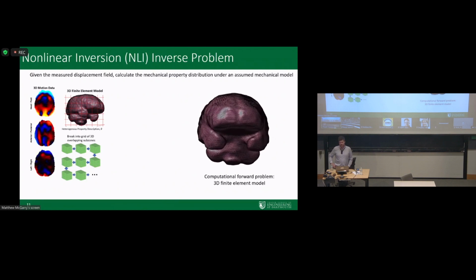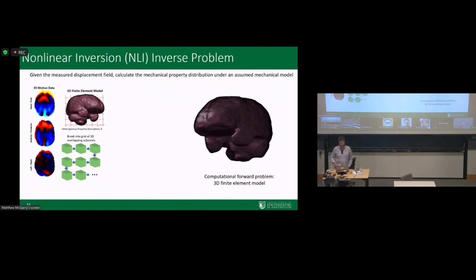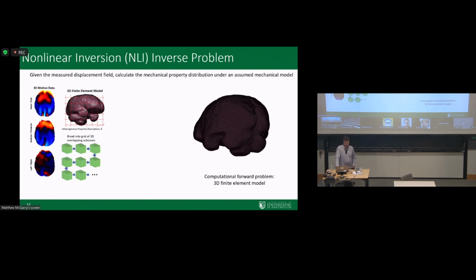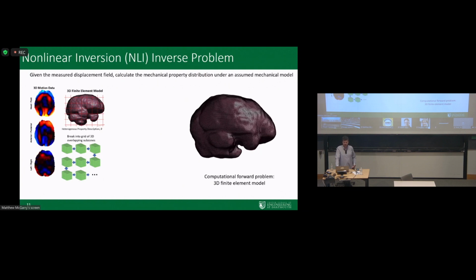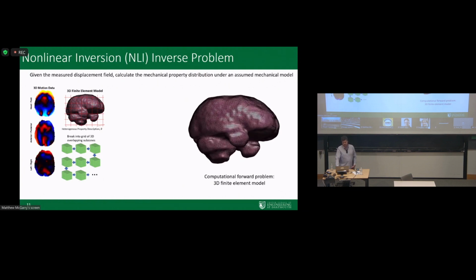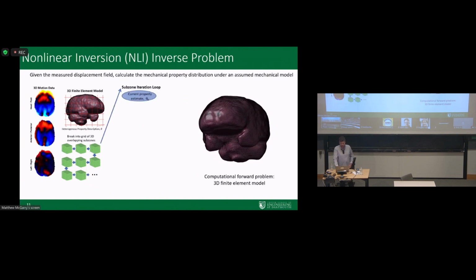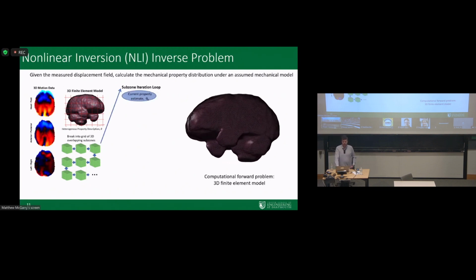So you're trying to invert a sort of million by million matrix. We break it up into a grid of overlapping subzones because we've got data everywhere. We can describe boundary conditions. We send each of those subzones off to its own separate processor on a high performance computing environment. And then we just do a standard optimization loop.